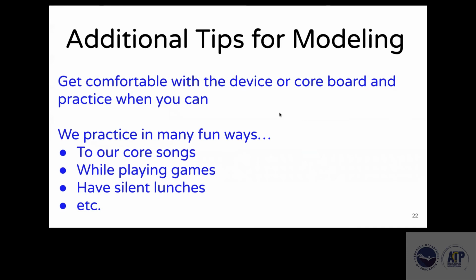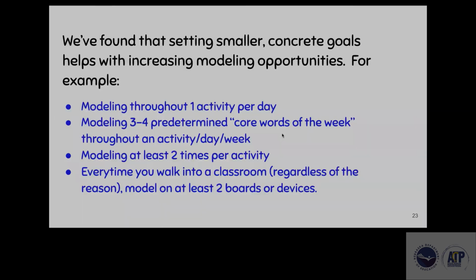And then also just playing games. I have some really fun games that the staff and I have come up with, and we really enjoy playing the games while using the boards and devices. We've also done other really fun things like a silent lunch or a silent snack time where you can only use the board or device to talk to people. So it really forces you to gain comfort on where the vocabulary is.